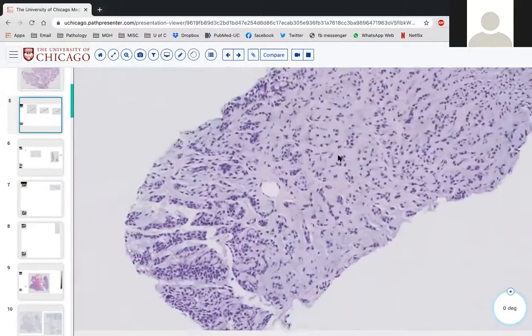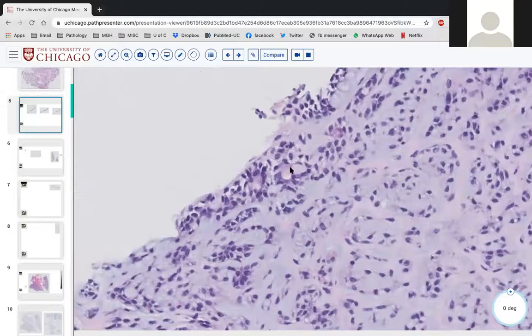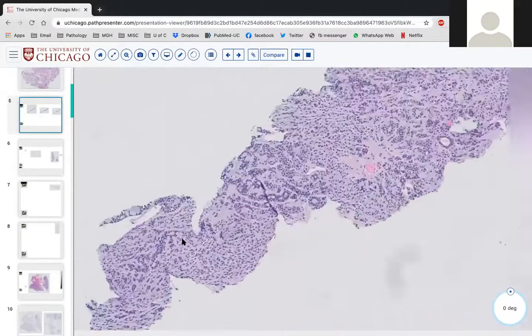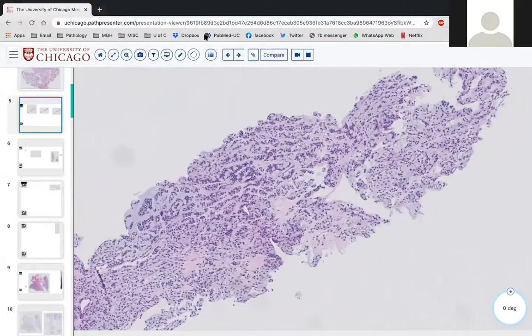Let's see, it's a mass in the right parotid and jaw discomfort. Let's see what else is there. Thinking of what it could be, a myoepithelioma possibly, but probably not.